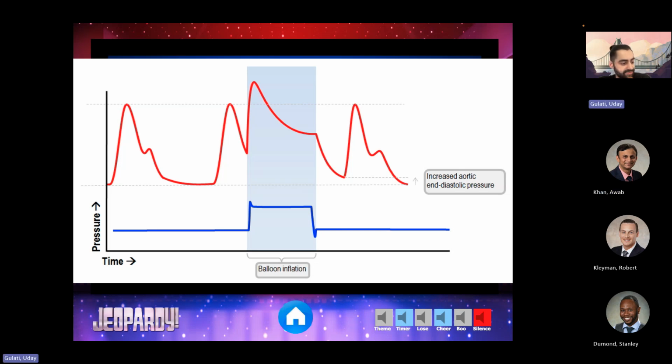I've seen two cases in Vineland where we decided to be brave and keep the patient in Vineland, and then perfusion just started to get worse. When we turned the balloon pump off, because we couldn't figure out how to change the inflation times, the patient's perfusion actually improved. I'm assuming that in that case, it was probably inflating too early.